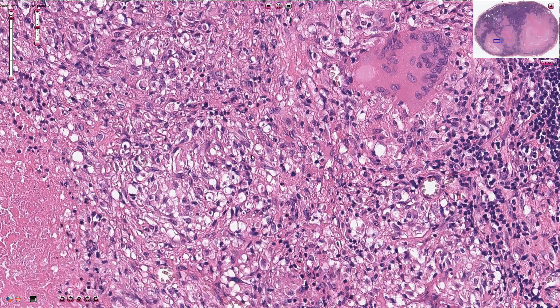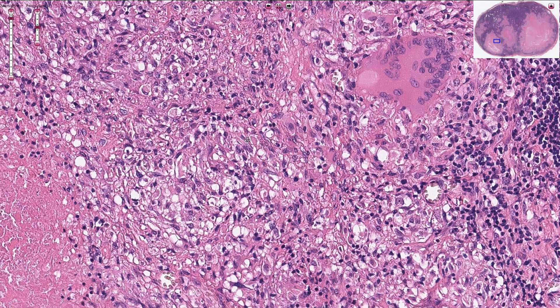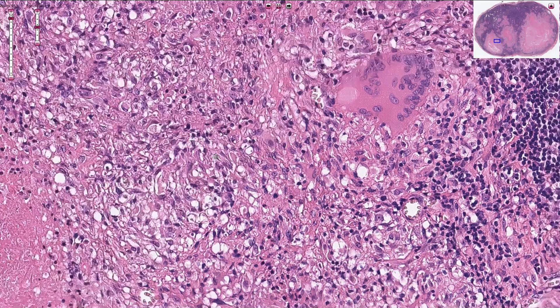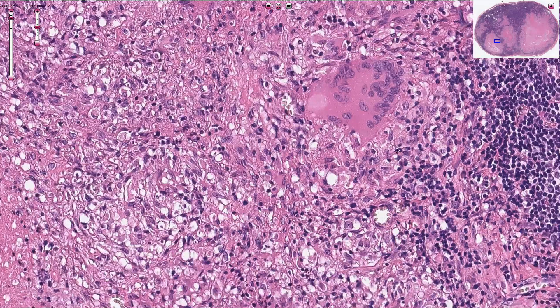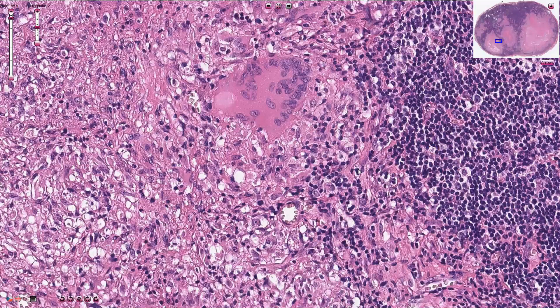Epithelioid cells are transformed macrophages that lost phagocytic capacity, and this transformation is part of the T cell-mediated reaction. TH1 cells are responsible for production of cytokines that drive this process, and we can see those lymphocytes here.